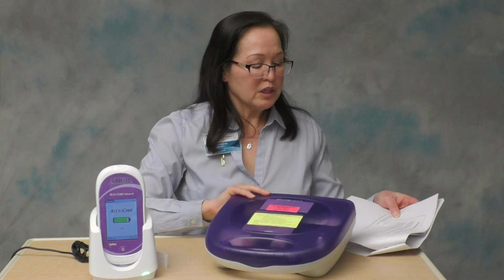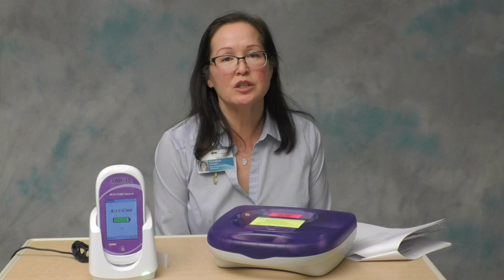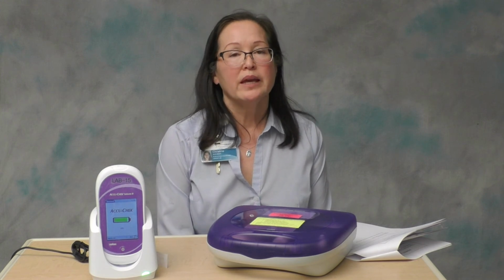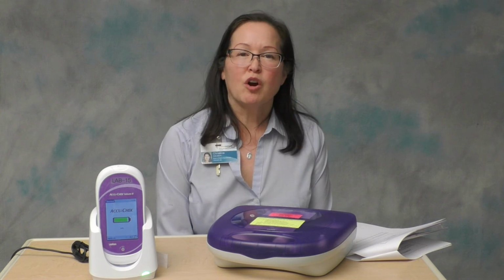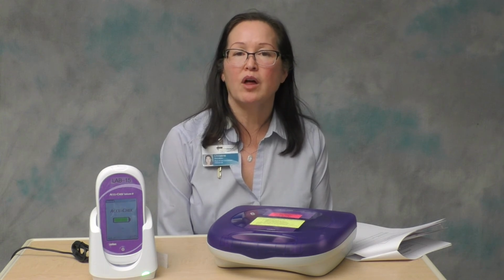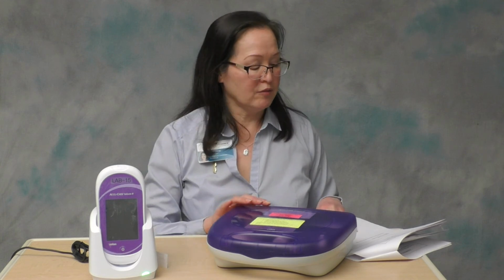Our critical values here: you need to follow nursing protocol for patient treatment and provider notification, and make sure that you are documenting your provider notification in Epic. It's not required that you repeat the test if you get a critical value, but it is required that you notify the provider and document that. For infants which are less than 1 year of age, the critical low is less than 45, the critical high greater than 150. Everyone else 1 year of age or older, the critical low is less than 50, the critical high greater than 500.